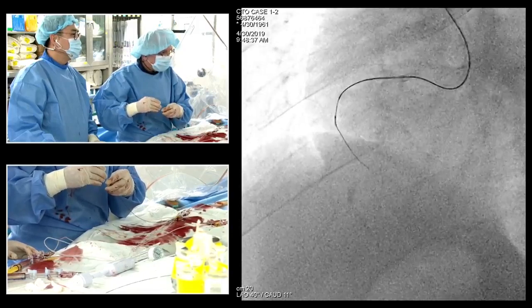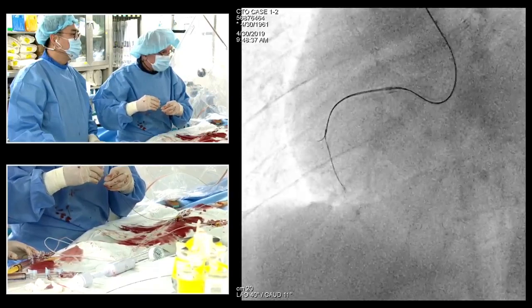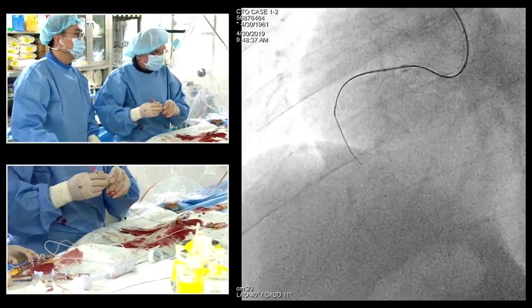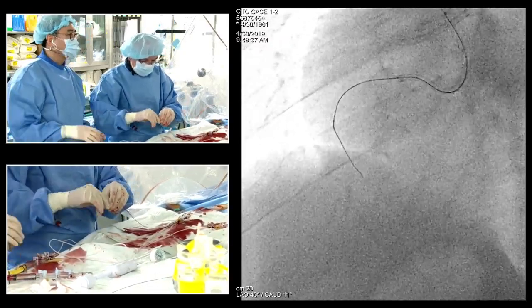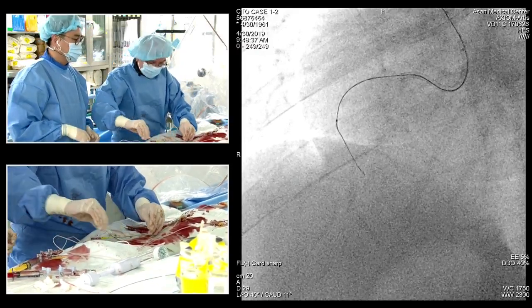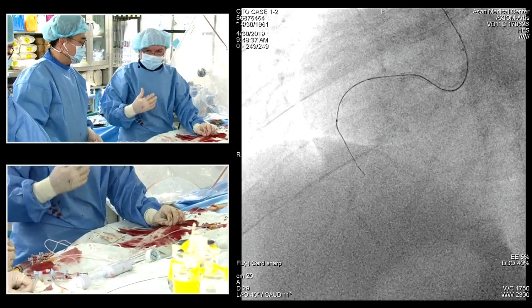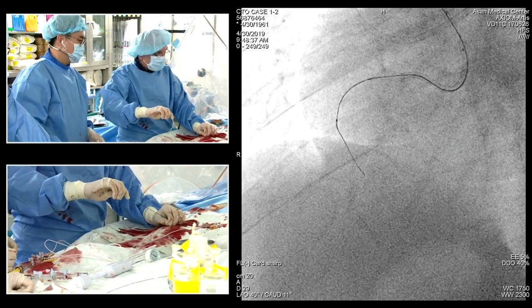Okay. The Sasuke actually doesn't make the. I think I have to. Okay. I will do something different. I need to dilate the proximal part. I'll just dilate the proximal part, because otherwise I lose the beauty of the Sasuke guidance if I have to repuncture every time. So we will fluoro-store everything, please.